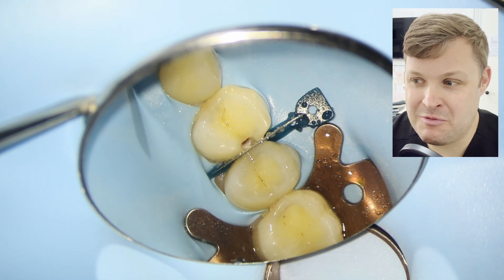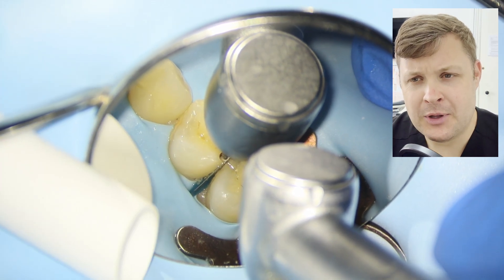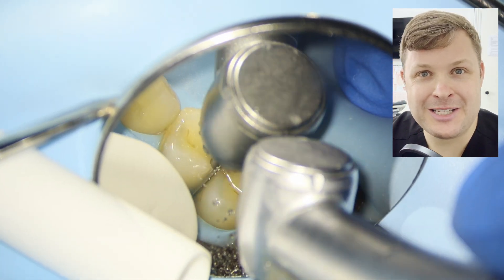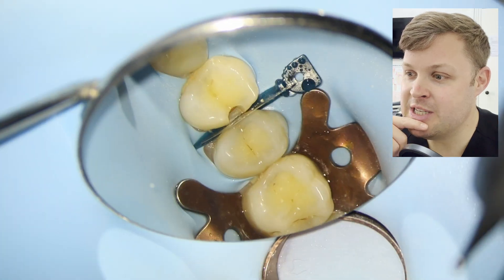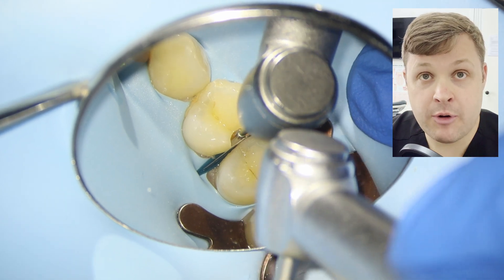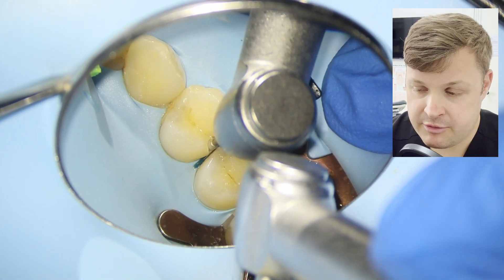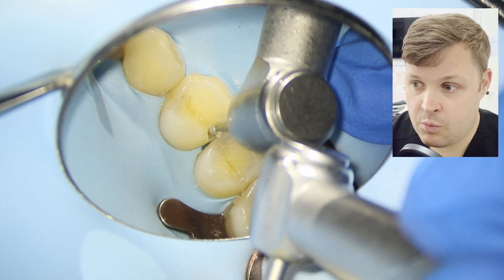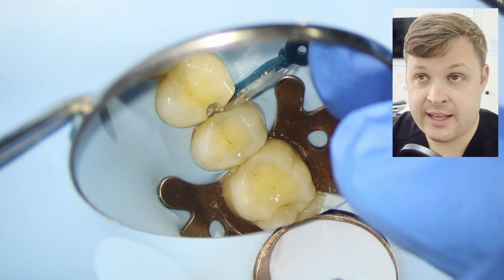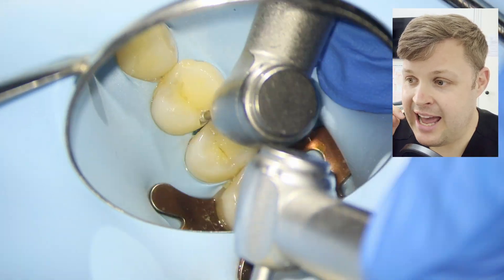Actually, when we remove the decay we find there's decay in the other surface too, but I don't want to detract from the learning experience. What we're using here is a wedge guard from the Paladent series of sectional matrices. Connected to this wedge is a silver strip, and what it does is protect the adjacent tooth from the drilling.